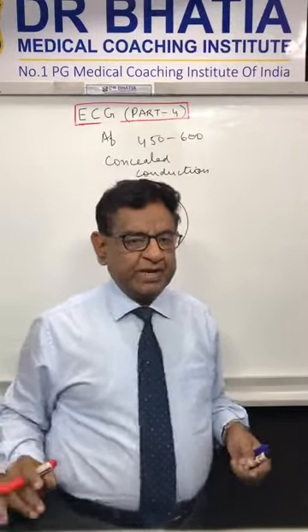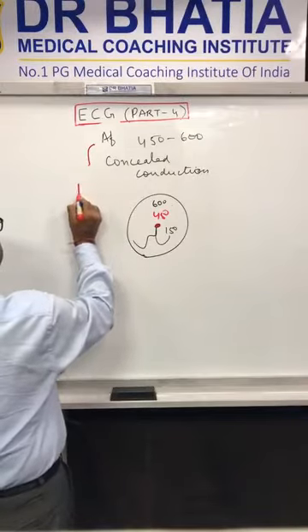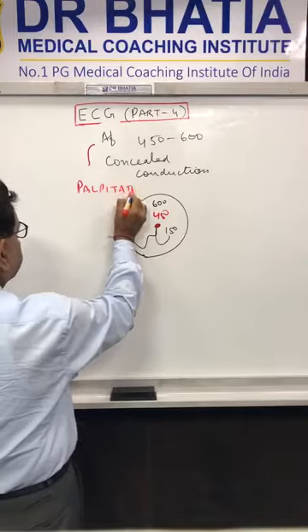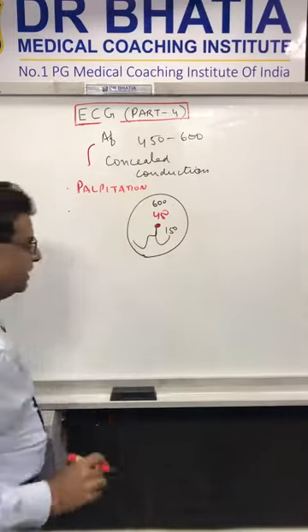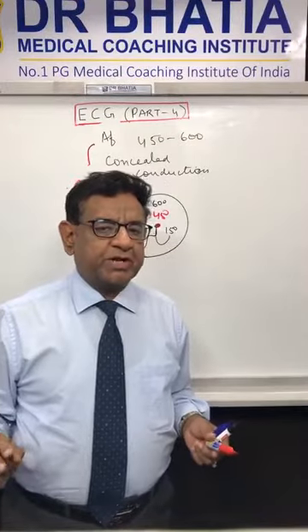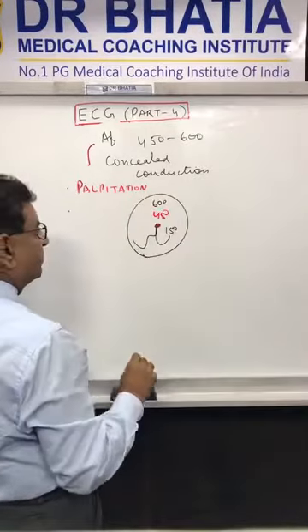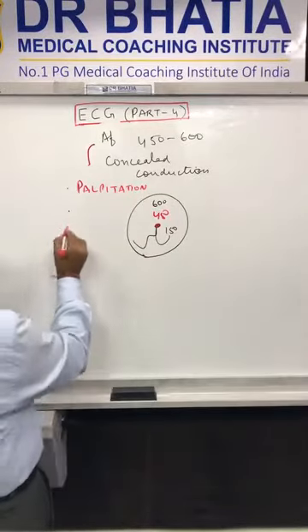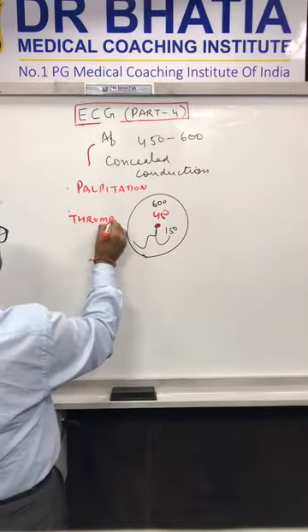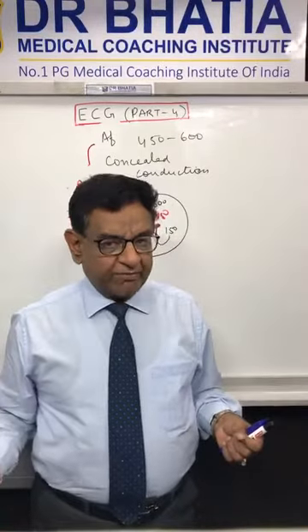Now the ventricle rate is 150. The ventricle rate is very high. That's why the commonest symptom of AF is palpitation. Number two, as there is no synchronized contraction of the atria, that leads to stasis of blood in both the atria, which predisposes to thrombus formation in both the atria, which later on can have embolic phenomena also.